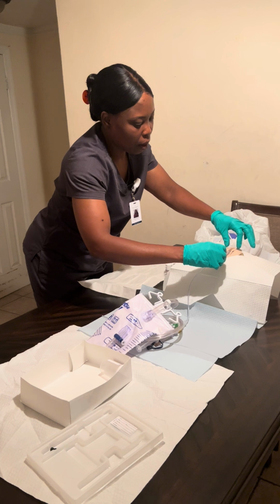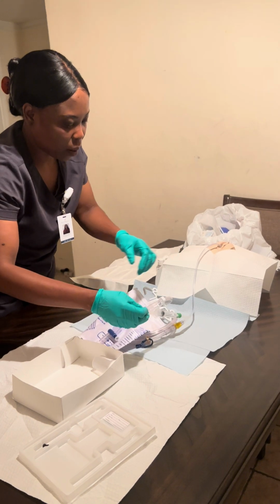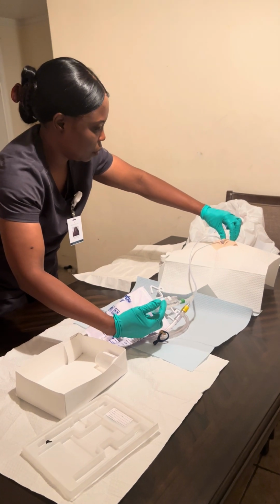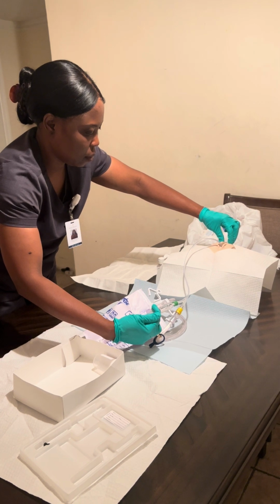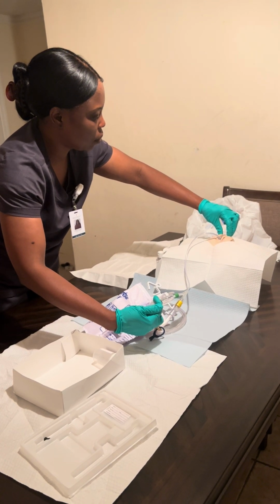I'm gonna make sure to secure the tube. Now I'm gonna put my 10 cc fluid. Okay, Mrs. Smith.